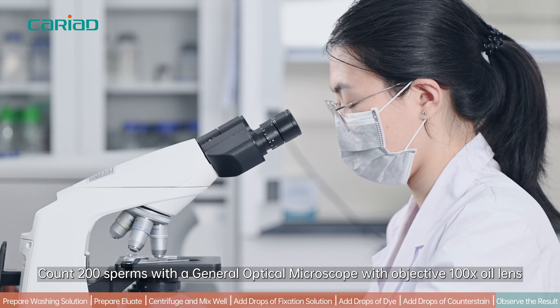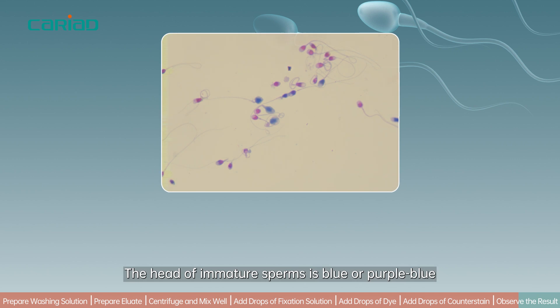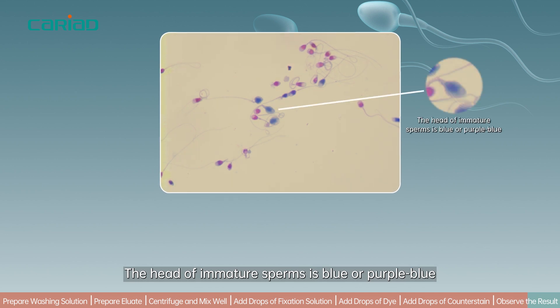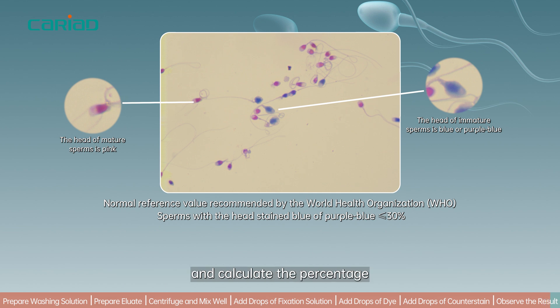Count 200 sperms using a general optical microscope with a 100× objective lens. The heads of immature sperms appear blue or purple-blue. Count the number of sperm cells with blue or purple-blue heads and calculate the percentage.